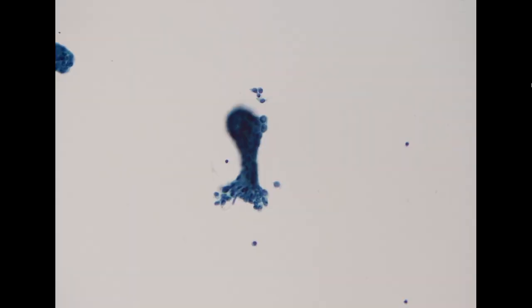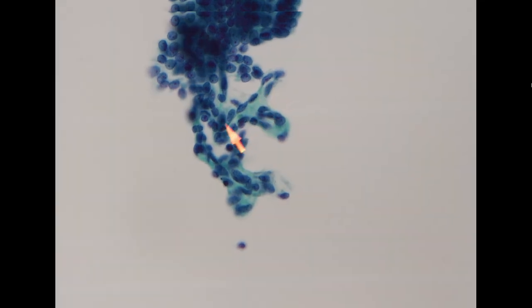Additionally, this is what we call an aborted papilla. You see a cluster with three sides showing luminal border and one side blunted. So this is a detached, decapitated papilla, also very typical for PTC. Here we start to see fibrovascular stroma. This is a true papilla because there are capillaries within these papillae, and there's a luminal border around these fibrovascular cores. So this is also a true papillary architecture.